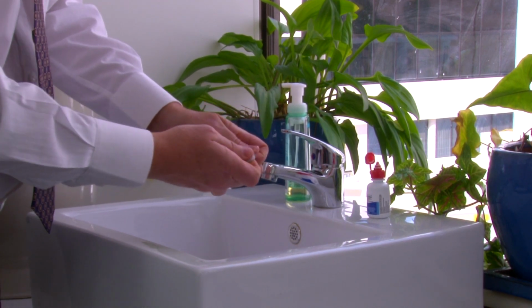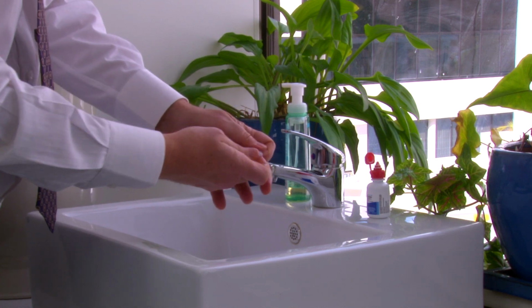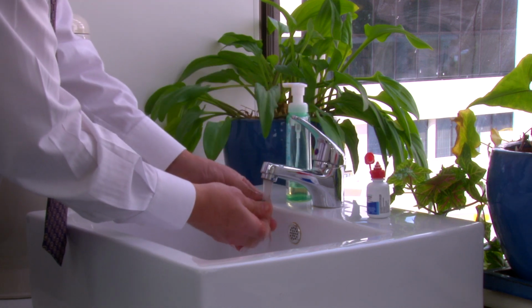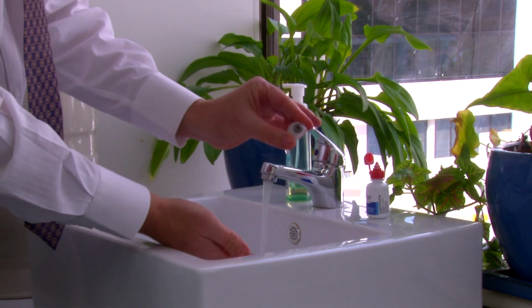You have to be careful that you don't put it into your eye. It does look like an eye drop. It's not an eye drop, it is soap. So you put it on the eye, you give it a good rub all over, and then you rinse it. And it is soapy, so you'll feel when the soap is all washed off, and then it's ready to return back into the eye socket. There's also an ultrasonic cleaner that you can use.